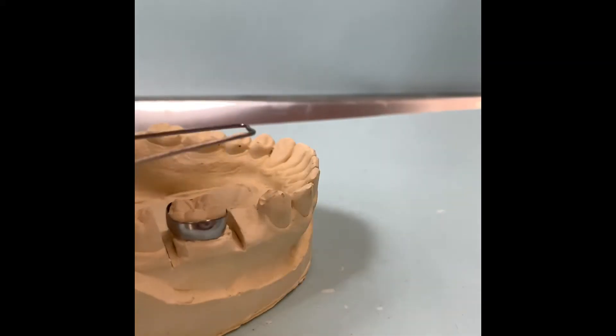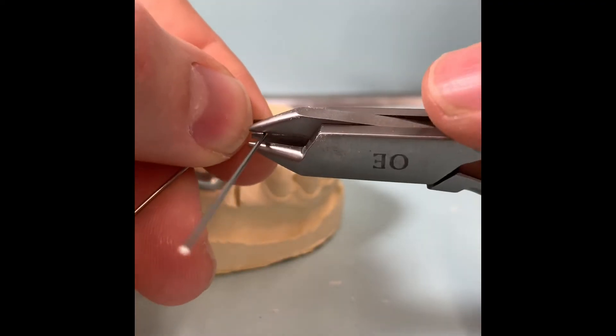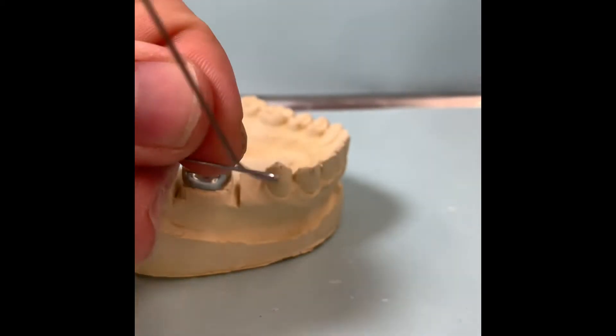We want to contour it, so this is where we're going to use our 3-pronged plier, the two beaks facing down, and then just a light pressure. We're going to contour it so it comes upward, just like that.